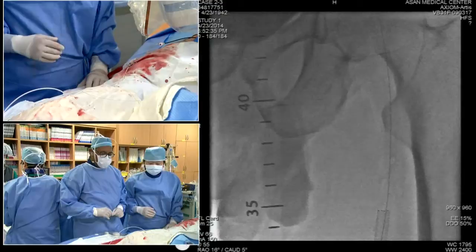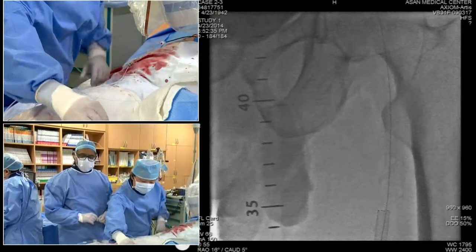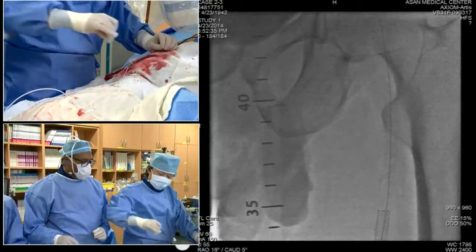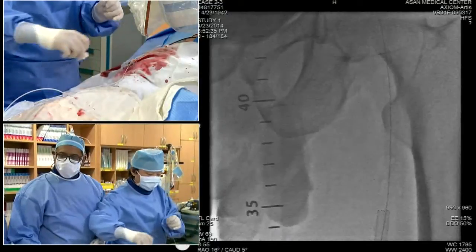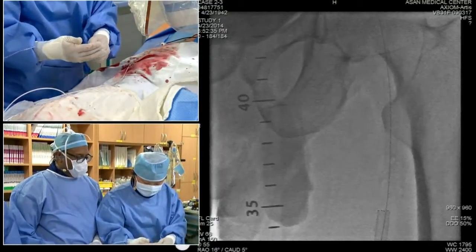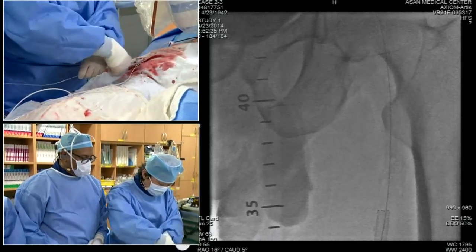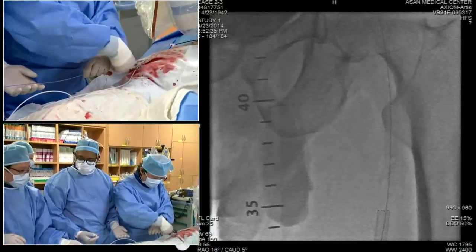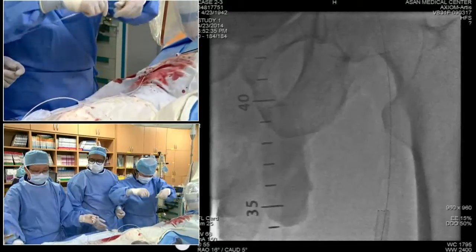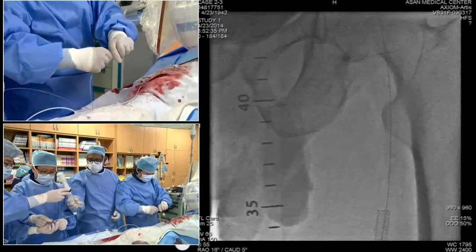Well, John, you would probably agree we're in uncharted territory with regards to the use of DEB in lesions this long with this technology in an adjudicated manner, where we have a heterogeneous environment with native disease and then again with in-stent restenosis. Wouldn't you want to stent this now? Isn't that really the answer here rather than a drug? You can always do a Viabahn and then come back with a drug-coated balloon later. I just wonder if this approach may be the right answer.